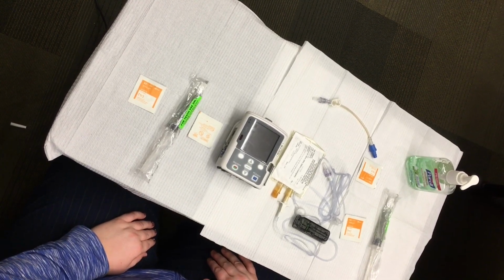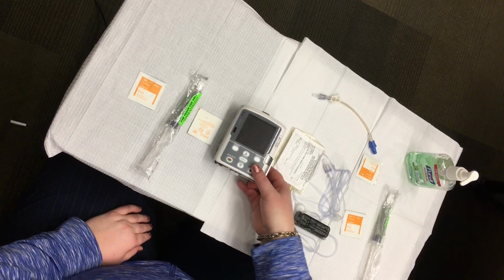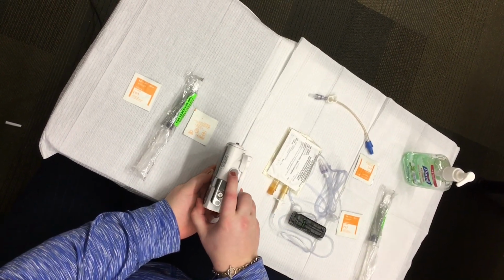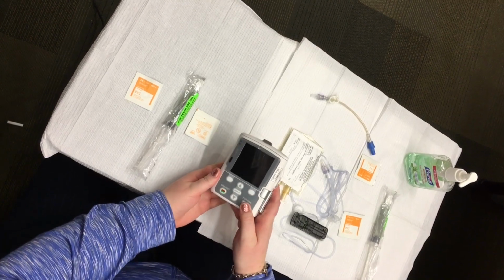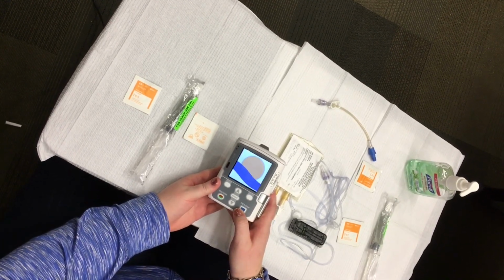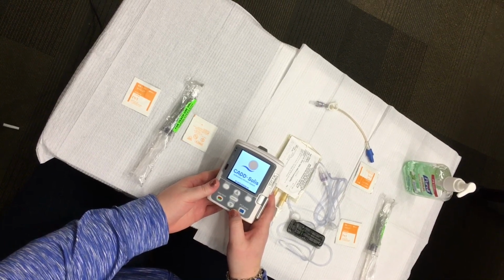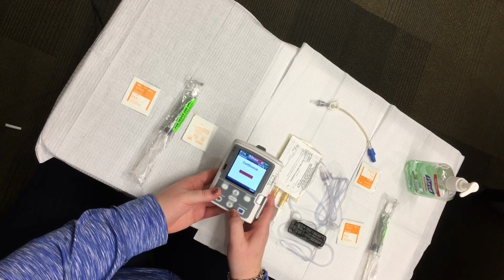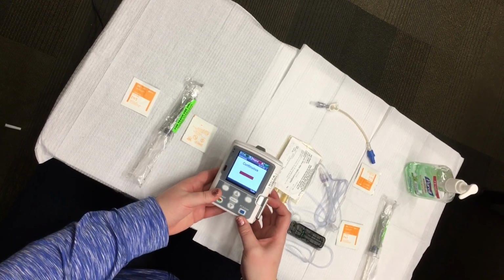With the new batteries in place, as described in the battery changing video, turn the pump on by pressing the power button on the right side of the pump. Please wait until the booting up process is complete and the screen displays ready to begin before proceeding to the next step. Lower the silver latch on the right side of the pump.